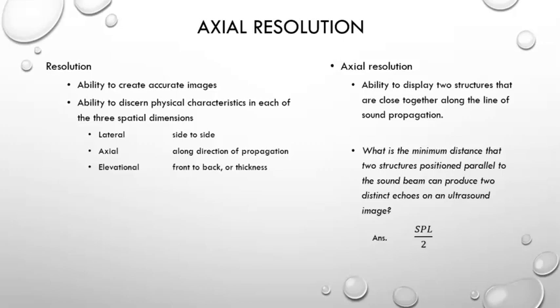So if we send a sound beam in and then we move over and send another one in and listen to the echoes come back, that different side-to-side is what we consider the lateral resolution. Now, elevational resolution is the thickness of the sound beam. This is when you hold your probe down transverse to the body, it's the portions above and below the probe, so up towards the head and towards the feet, not side to side, that is being able to be resolved. So this is the actual thickness of the sound beam.